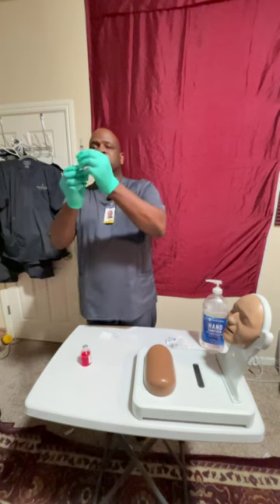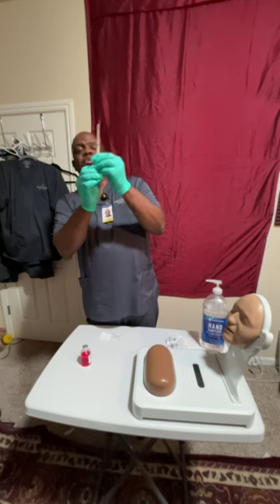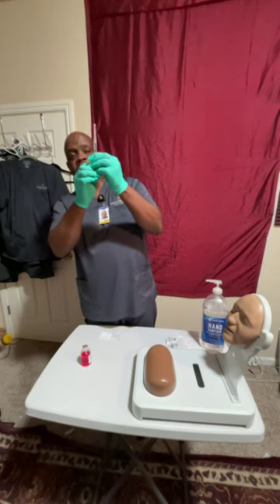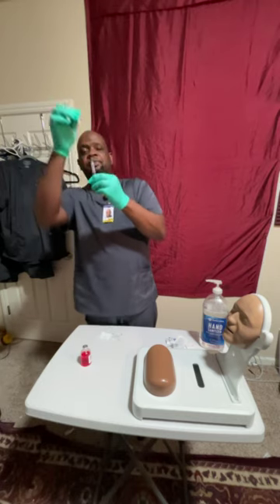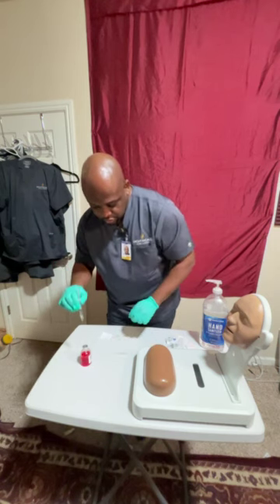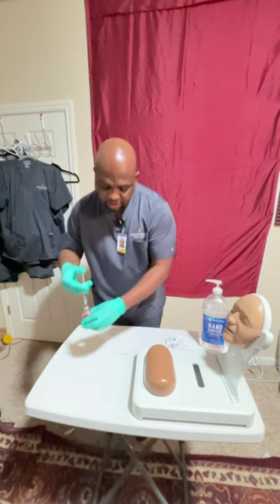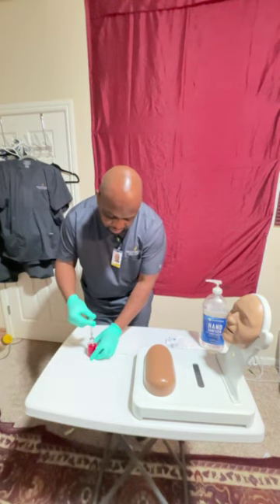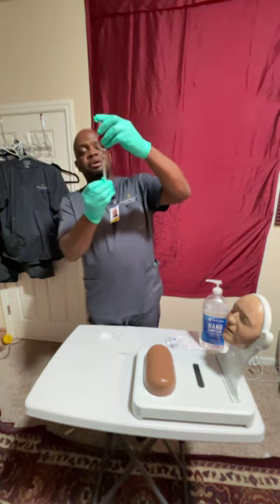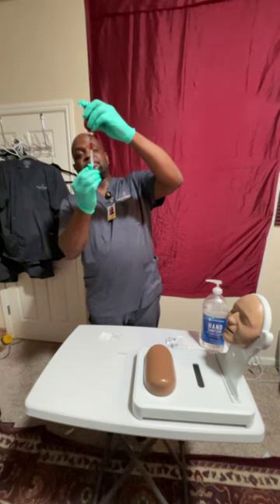So I am going to draw up 1.5 mLs of air. I'm going to leave the cap on the syringe, and I'm going to draw up 1.5 mLs of air. Now I'm going to remove the cap, and I am going to make sure I keep the cap close by. I'm going to inject 1.5 mL of air into the medication bottle, right? Now I'm going to invert the bottle, and that's the amount I'm going to pull out. 1.5 mL of medication, right?